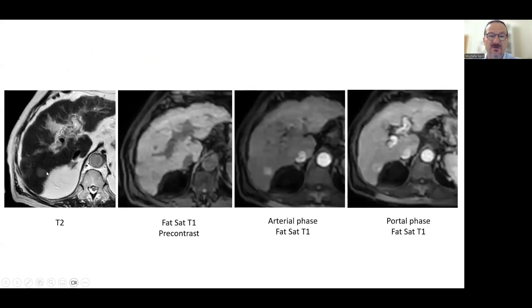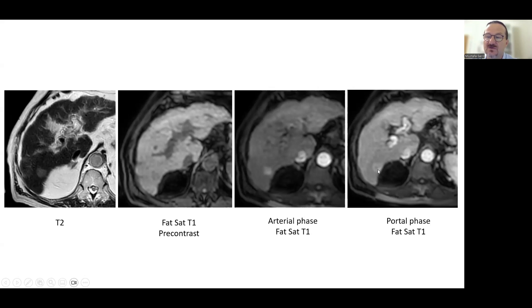This is a hepatocellular carcinoma, slightly hyper-intense on T2, slightly hypo-intense on T1, with early arterial enhancement and non-peripheral washout. The center shows washout and the capsule shows enhancement.